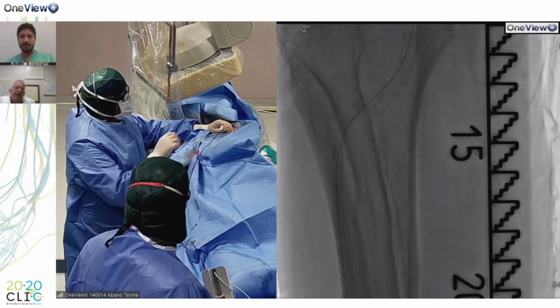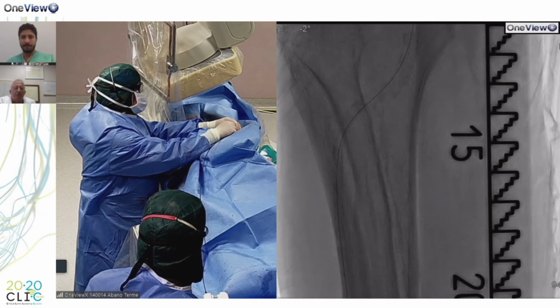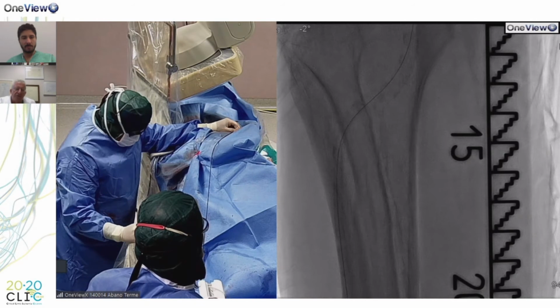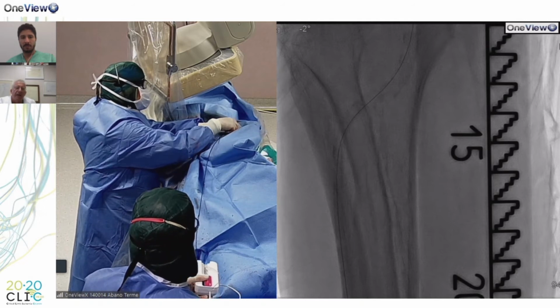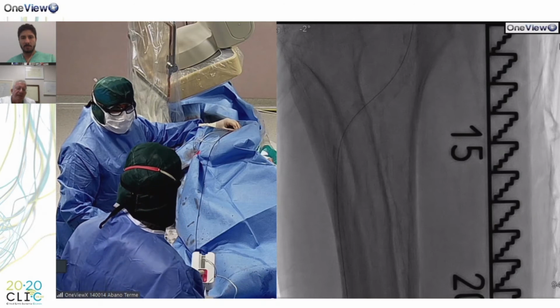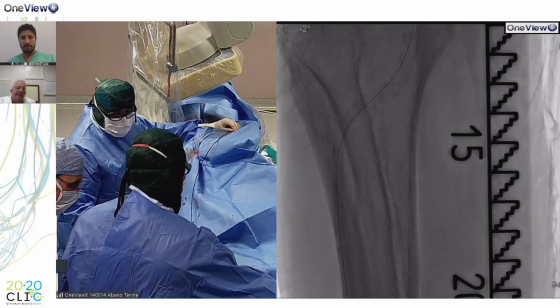Marco, tell me, Mariano. When you use IVUS, you have to spend time to use it, but it's very useful because you can appreciate how much you can open the lumen and get more around the calcium plaque, just around, and to have more space.